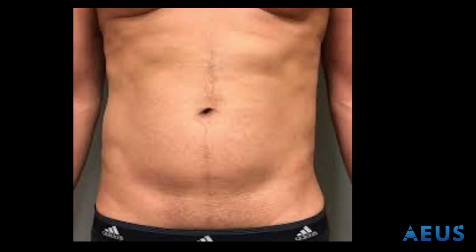This is my preferred scanning technique. First, I ask the patient to point with one finger at the area of maximum tenderness. Then I choose my probe of choice, which is usually a linear probe. Given the high resolution, it is a great choice for an appendix ultrasound. However, after 5 to 6 centimeters in depth, the images can be less than ideal.